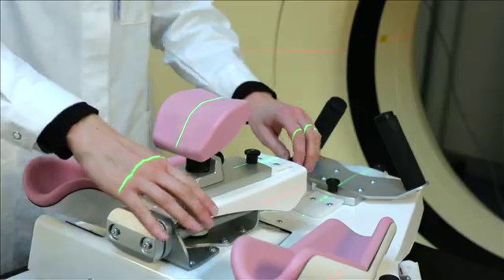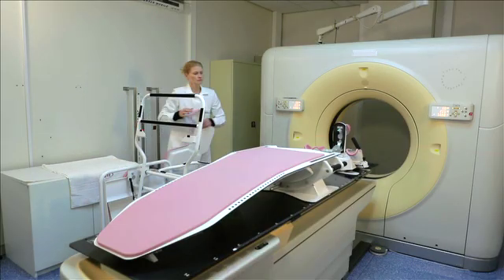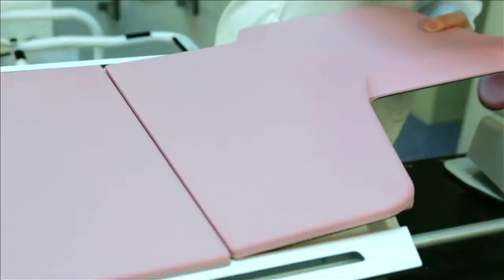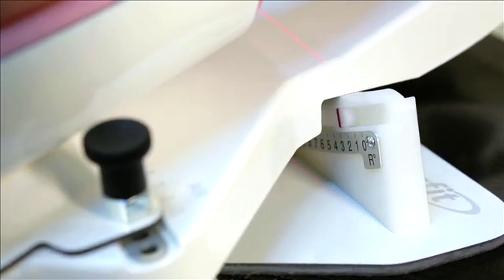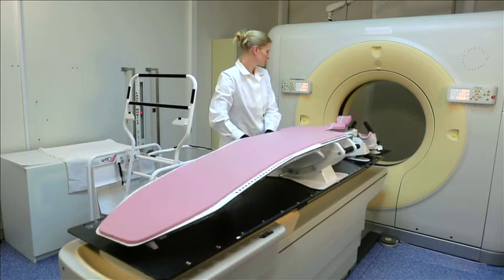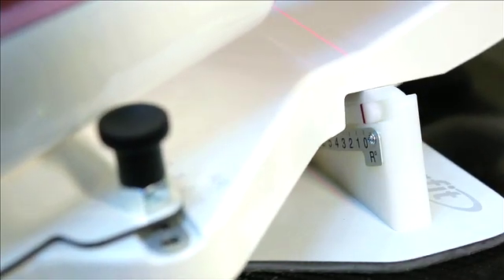Open the forehead support. Choose the left or right breast bridge depending on which side of the patient will be treated. Insert the front end of the bridge and close the forehead support again. Rotate the Sagittilt ten degrees to the left and ten degrees to the right to make sure it is stable on the couch, then place it back in the zero degree position.